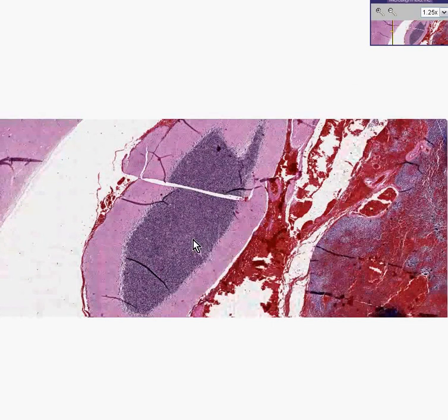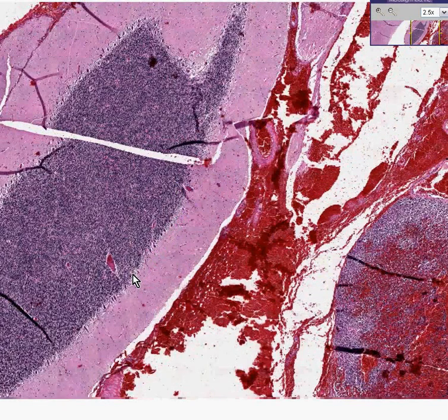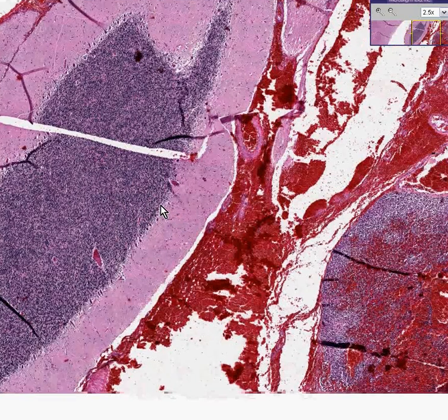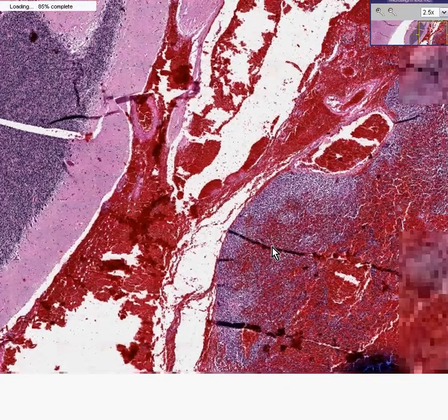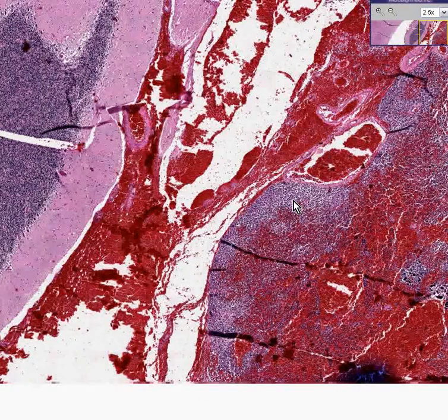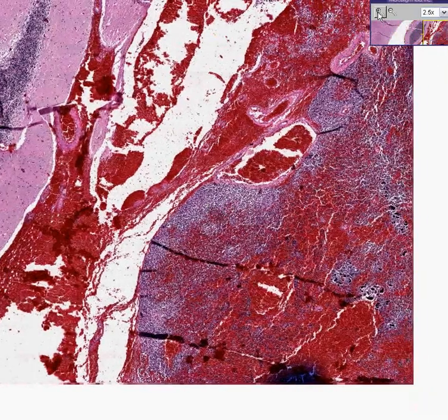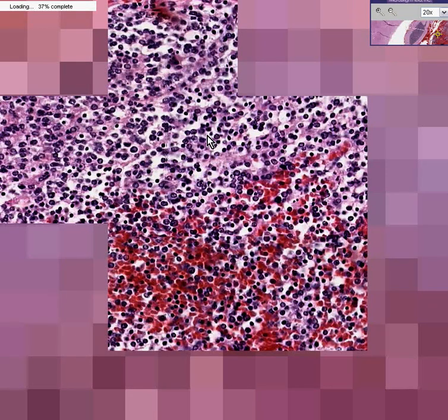You can see that this is a classical cerebellum. You can see these large Purkinje cells at the edge of these granular cells here. And then you could see meninges, and then you could see some more tissue which doesn't look like there's differentiation between gray matter, white matter, folia, Purkinje cells at all. This is really an unorganized mess of very primitively looking tumor cells, relatively small nuclei, but extremely vascular and extremely hemorrhagic, as you could see here.